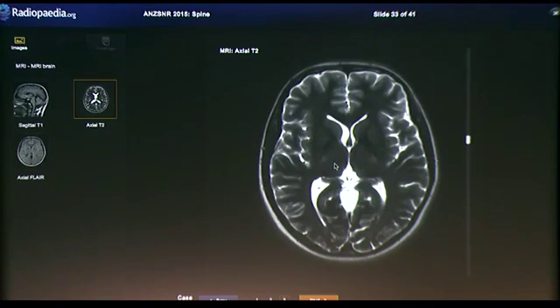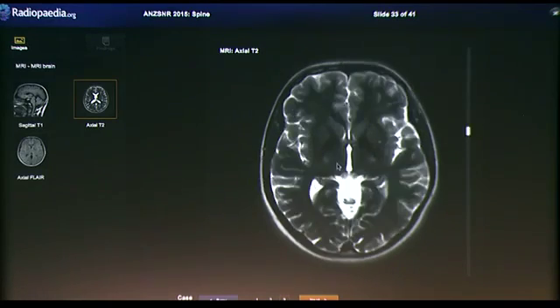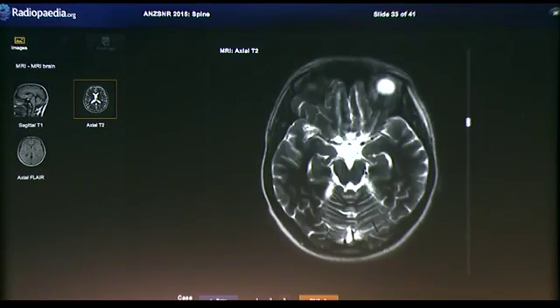So a lot of these viruses that attack the anterior horn cells can also present with rhombencephalitis or a coexistent rhombencephalitis and myelitis. The flaviviruses like Japanese encephalitis have a tendency to be associated with thalamic signal abnormality. So those are other additional features that you can look for.